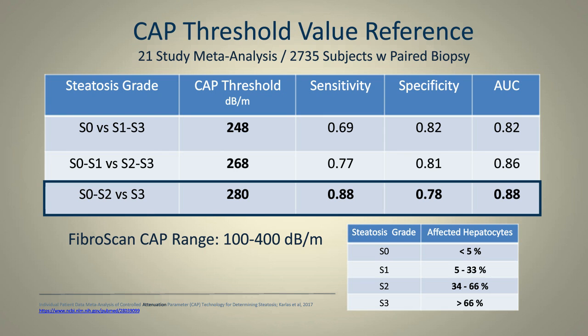In fact, I can use it to help me, and I'll give you a case. So a lady I saw less than an hour ago, when I started seeing her a year ago, her CAP was 320, I believe. Today, it's 220. So it's dropped about 100 units. And she's also lost a significant amount of weight and has changed her lifestyle and increased her exercise. So I feel very confident in telling that lady that she now has gone from fatty liver to no fatty liver in 1 year period of time. So that's also very helpful for our patients.